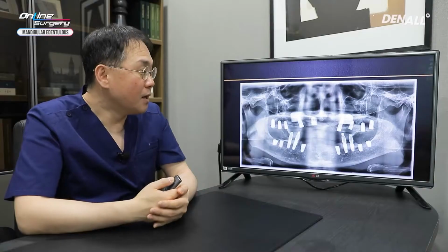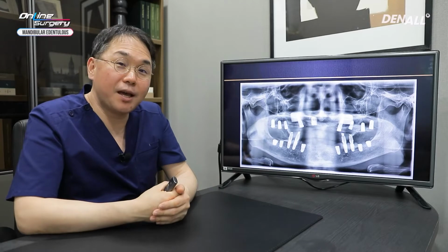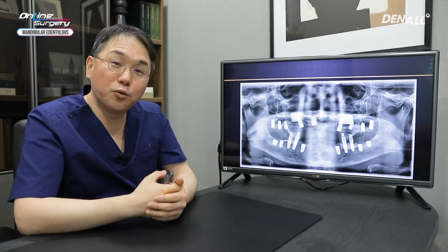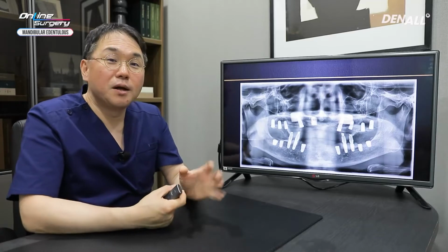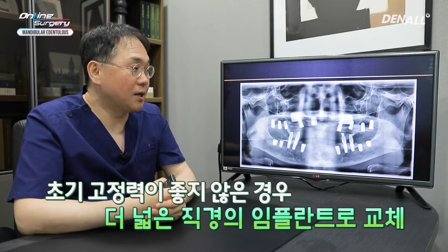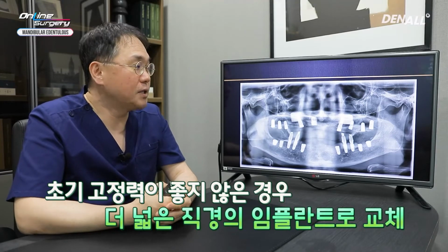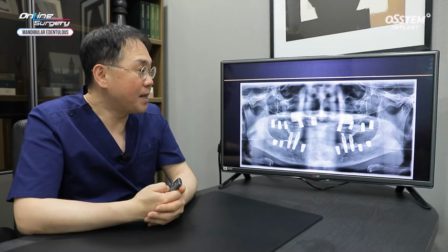As shown, when we first planned, I planned for placing a 5.0 by 8.5 implant on number 7 on both sides. However, after surgery, you can see that on the right side, a 7.0 diameter implant is placed, and on the left, number 37, a 6.0 diameter implant was placed. As shown in the clip, if you place a 5.0 implant and if stability is not good, you can change immediately to ultra wide diameter 6.0 or 7.0, and that'll lead to better results. This was how it was placed.